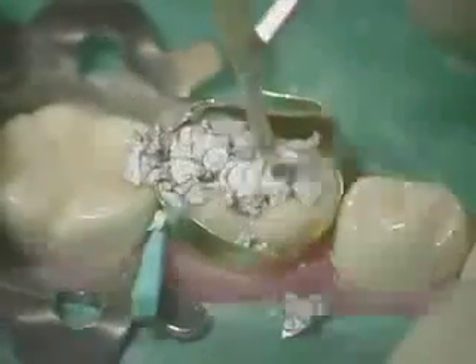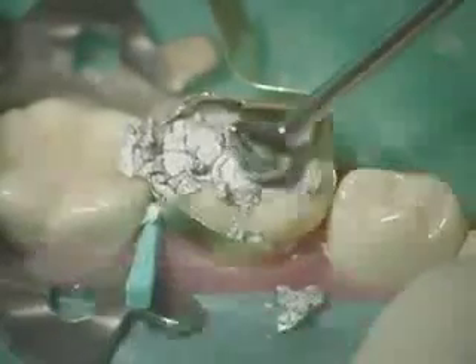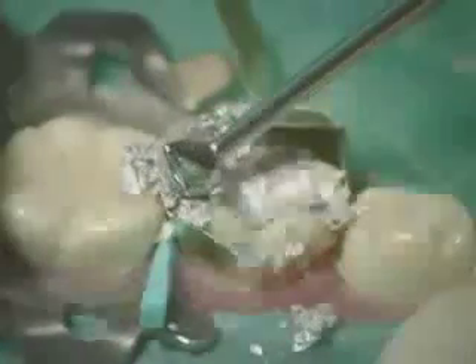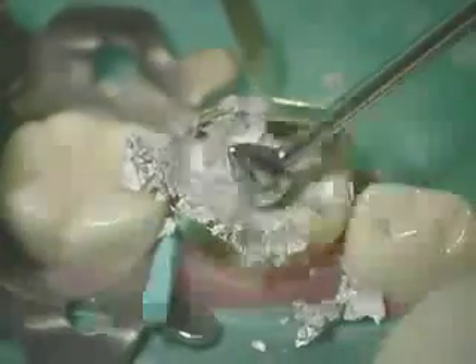Cover all of the cavosurface margins and build up marginal ridge height, well beyond that of the adjacent tooth. Once the amalgam has been placed, clean the excess material using the large ball burnisher. Use it in the movement of a carver, carving off excess amalgam in order to reveal the outline form of the cavosurface margin of the preparation.